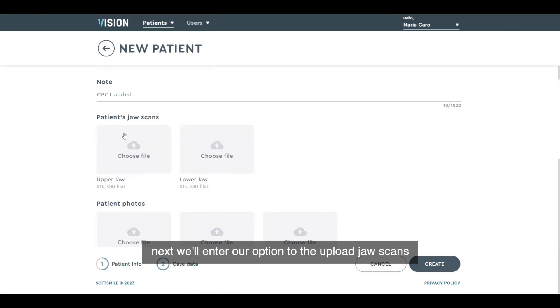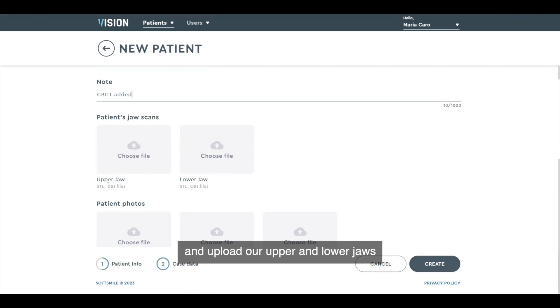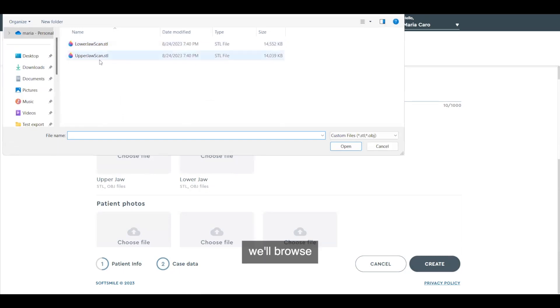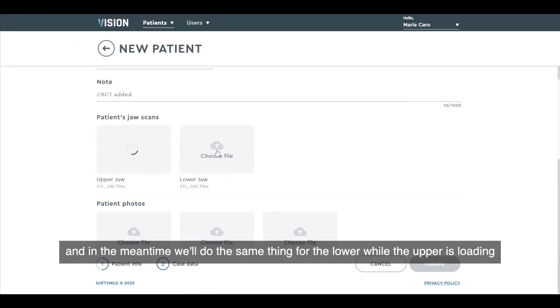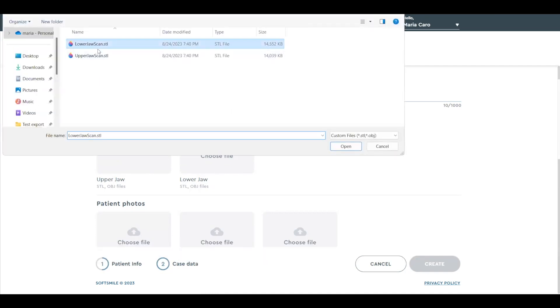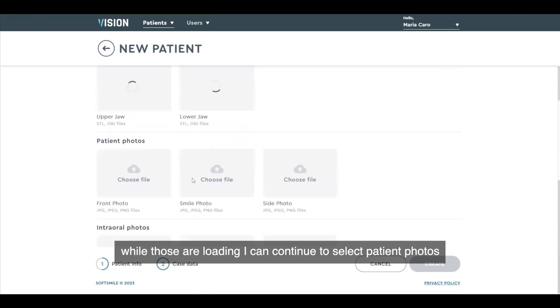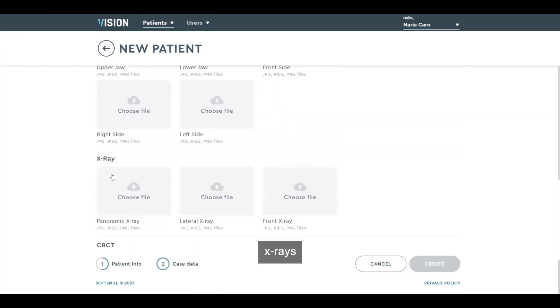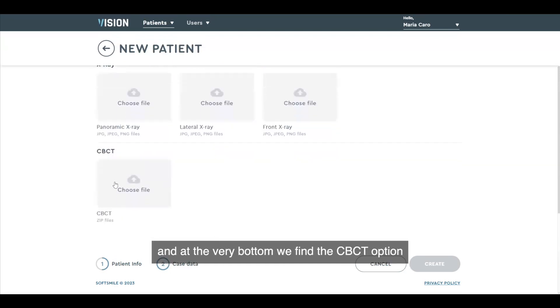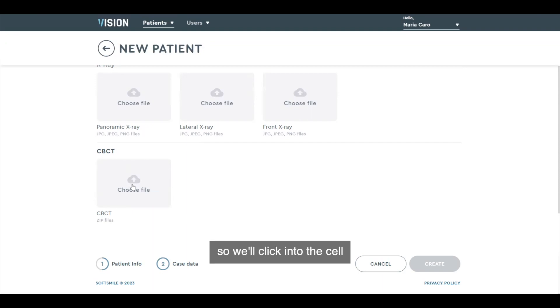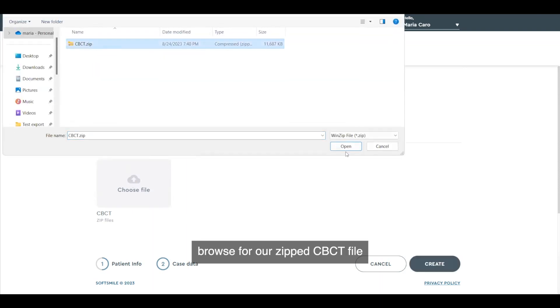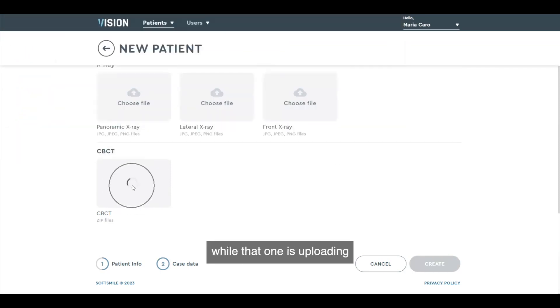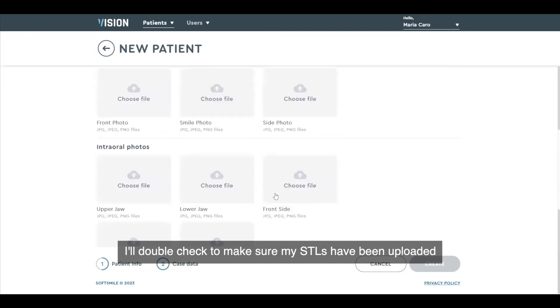Next, we'll enter our option to upload the patient's jaw scan. We'll simply select the cell by clicking into it and upload our upper and lower jaws. We'll browse and select the case. In the meantime, we'll do the same thing for the lower while the upper is loading. While those are loading, I can continue to select any patient photos, intraoral photos, x-rays, images like panoramics, and at the very bottom we find the CBCT option. We'll click into the cell, browse for our zipped CBCT file, and upload it.